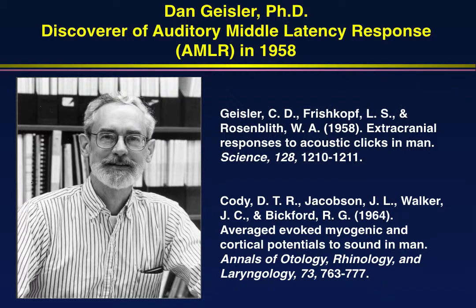In 1958, he developed a very, very primitive, by our standards, computer. And he could use that computer to signal average brain activity during auditory stimulation in human beings. And what he found was that there was a response arising from the auditory cortex. Well, at that point, he knew it was arising from the brain. He didn't know quite where. And it was not a muscle response. It was a real neurogenic brain response.